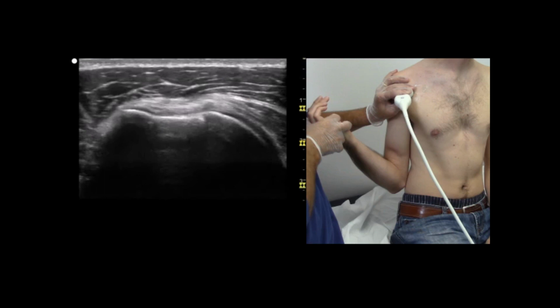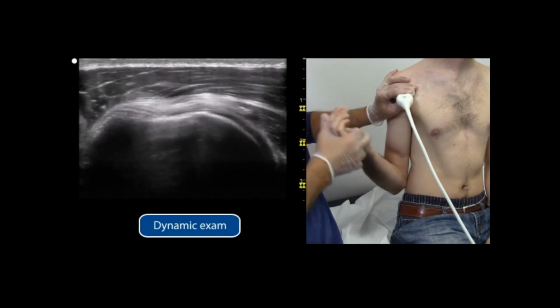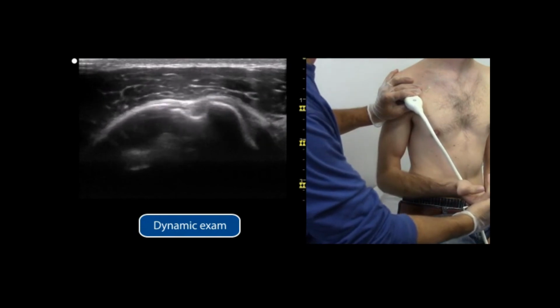One of the great things about musculoskeletal ultrasound is that one can typically use the opposite extremity for comparison. So, if one is not certain whether an ultrasound finding represents a pathologic condition, one can use the contralateral extremity as a point of reference.